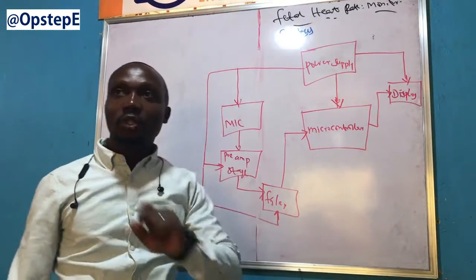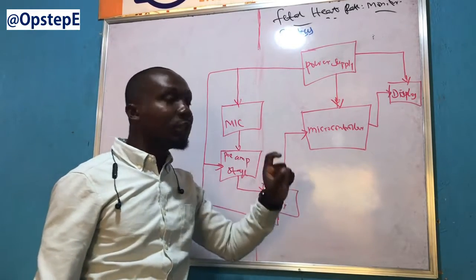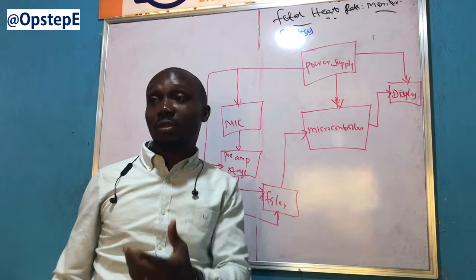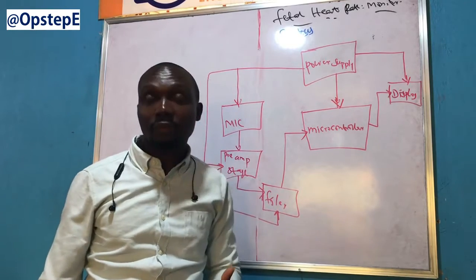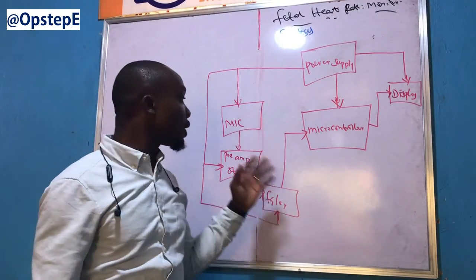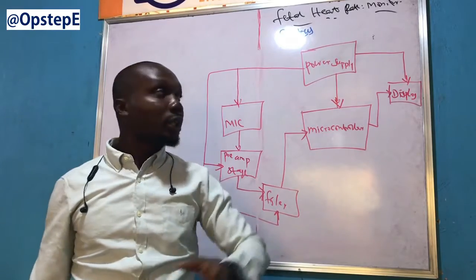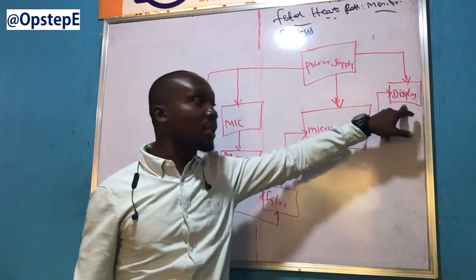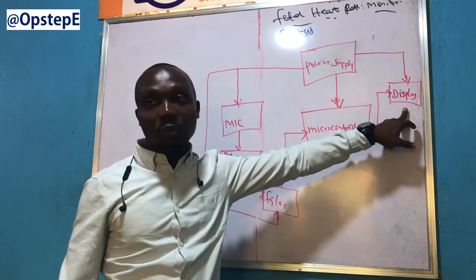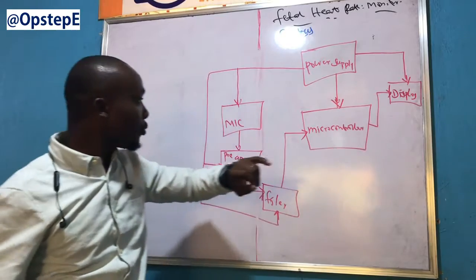When the reading is gotten, you would need a means through which you can make sense of what is read. If the pulses are gotten, there needs to be a way to have it interpreted to you. The best way to have it interpreted is to have it displayed to us. What kind of display we'll be using will be determined as we progress in this introduction.